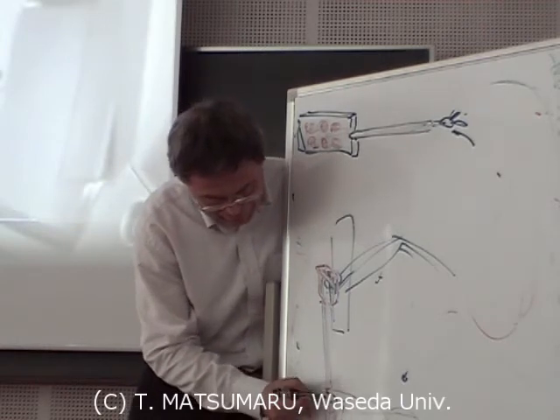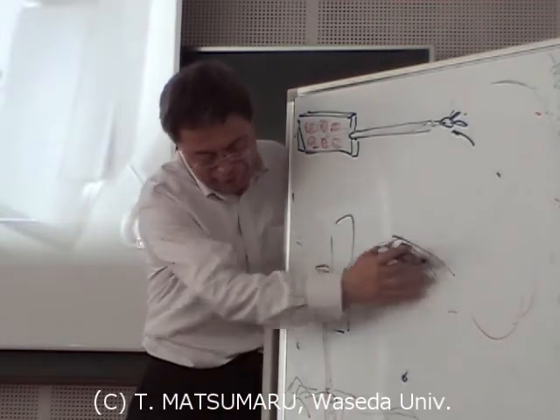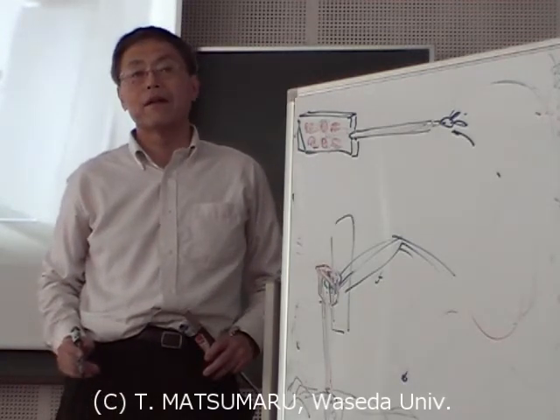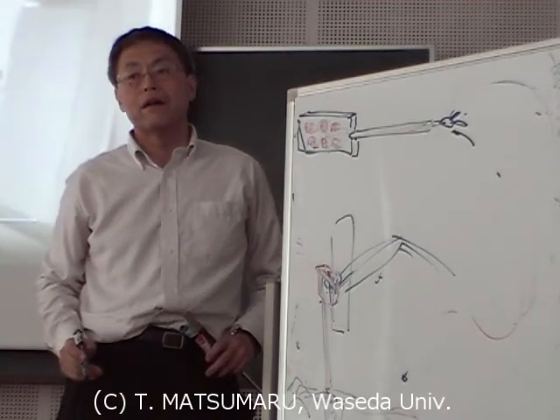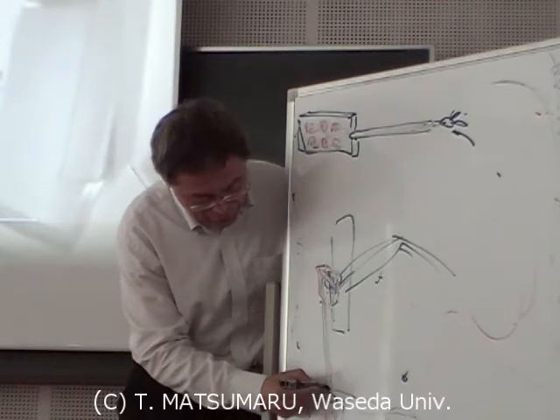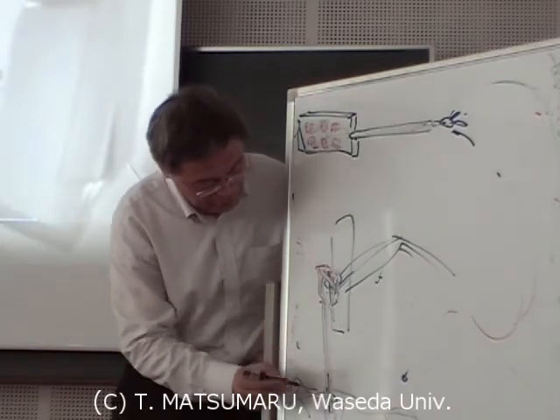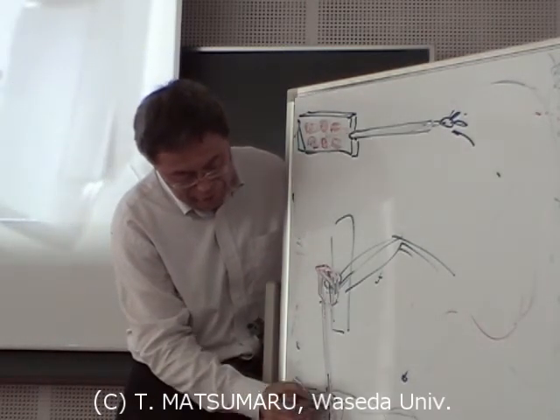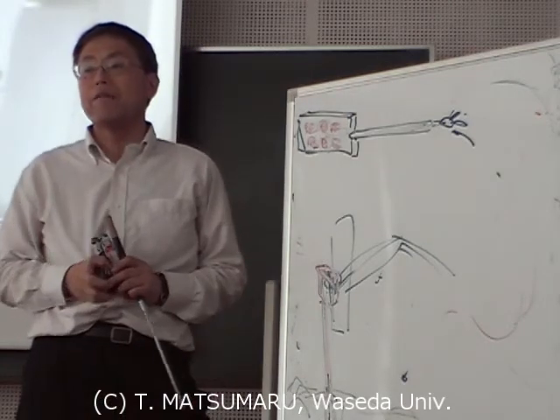Through this small hole this part is inserted, and then it moves more widely inside. They can reduce the pain of the patient. So it uses only a small hole, and this pivot movement is necessary to perform surgical operations.